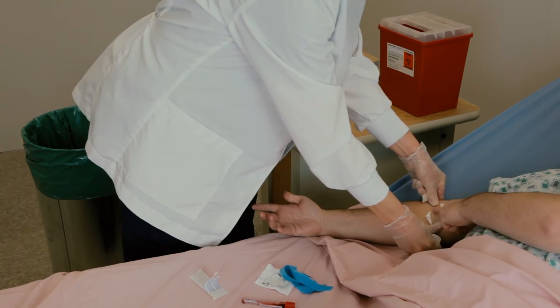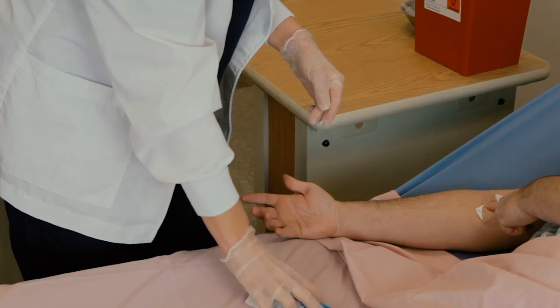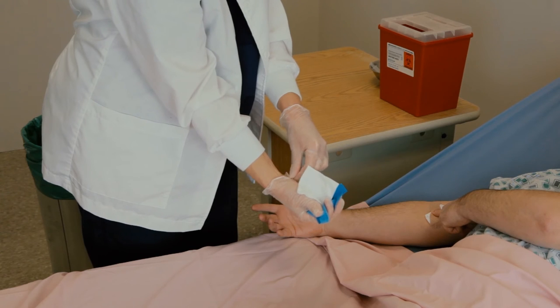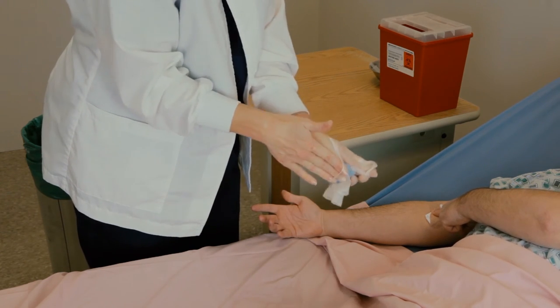Notice that the caregiver can see the tourniquet in the discard pile. As a best practice, the caregiver picks up the discard pile contents, ensuring one last time that the tourniquet is present and has, in fact, been removed from the patient. The caregiver then pulls off the glove while holding the tourniquet and other discarded trash.